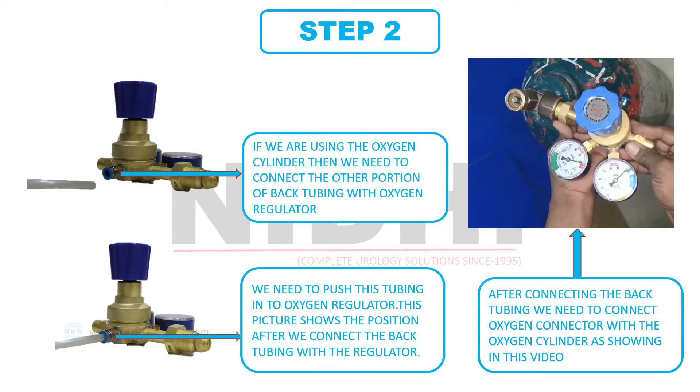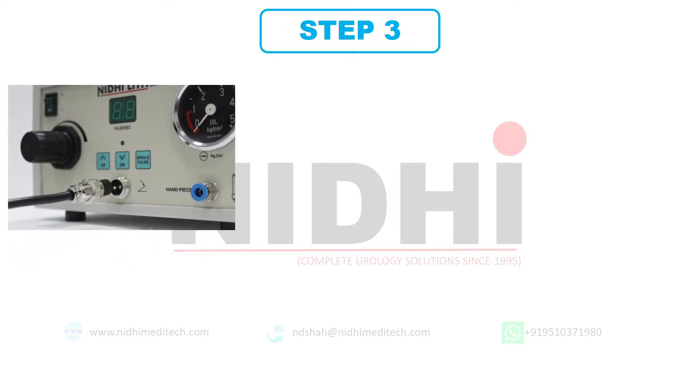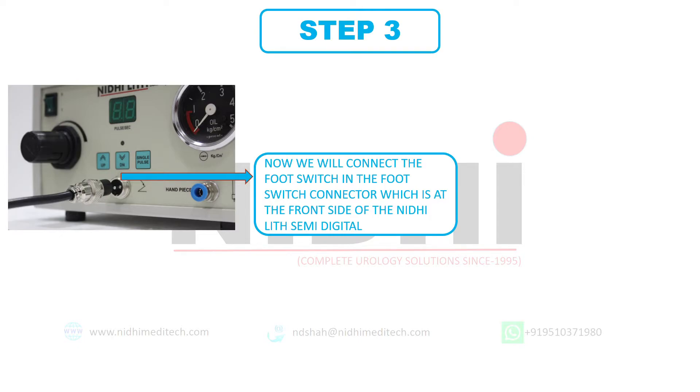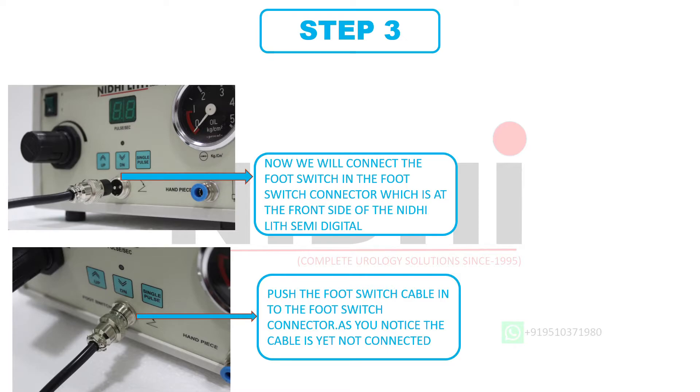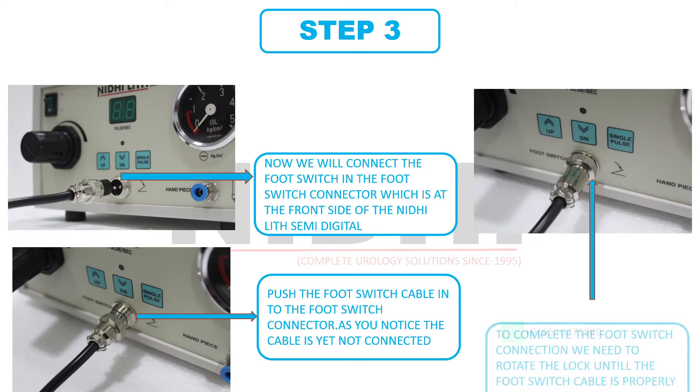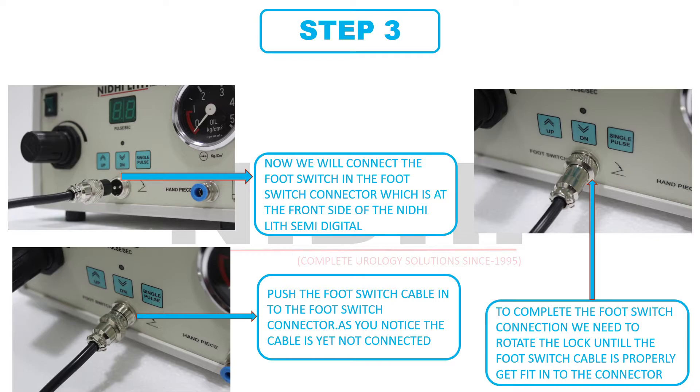I hope you have completed this connection successfully. Now let's move towards step 3. At this stage, we will connect the footswitch into the footswitch connector, which is at the front side of the Nidilit Semi-Digital control unit. This is the footswitch connector and this is the handpiece connector. Now push the footswitch cable into the footswitch connector. As we can observe in this image, the footswitch connector is not locked properly. By rotating this lock, we can complete the connection of the footswitch with the control unit. This image shows the perfect connection of footswitch and the control unit.